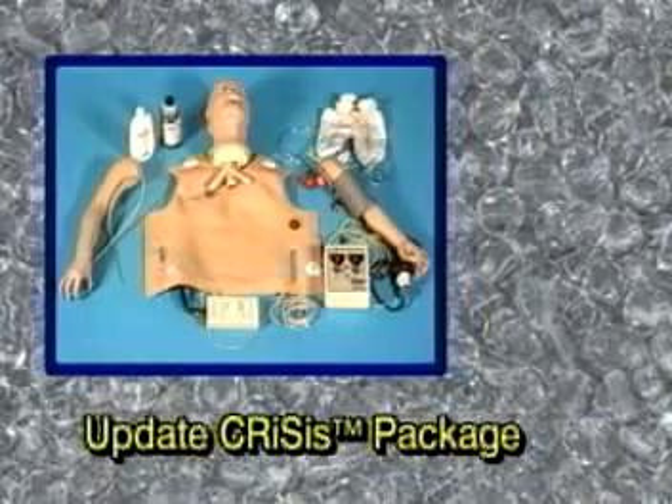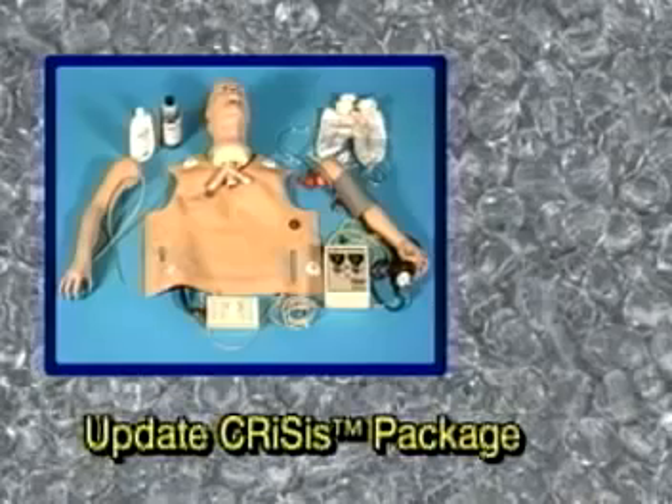Although we recommend the complete mannequins, the components can be purchased separately to update your older mannequins.